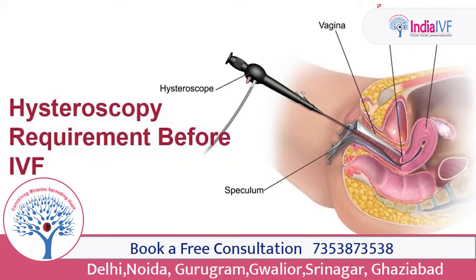So today let us discuss hysteroscopy, the role of hysteroscopy in IVF cycles, and when and why we should do it.